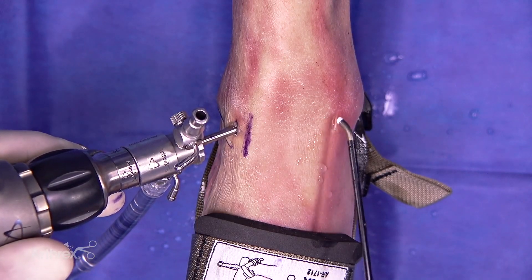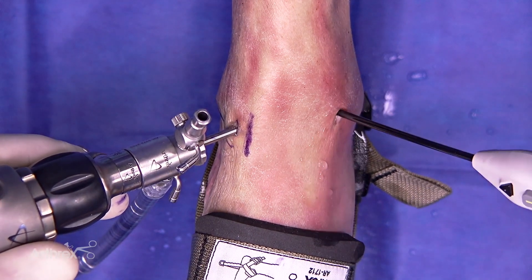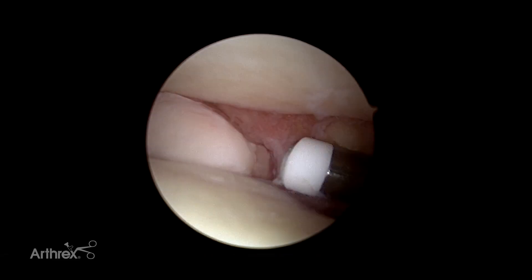I put my curve — the tip of my probe — at 90 degrees into the joint, then I lift my hand and it just goes in very quickly and easily. That keeps you from struggling with the probe because once the probe's in, it'll do the work for you.